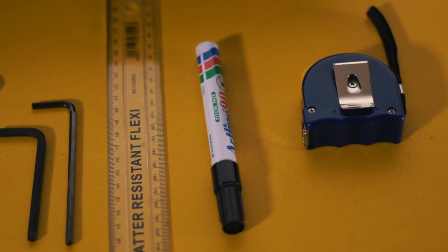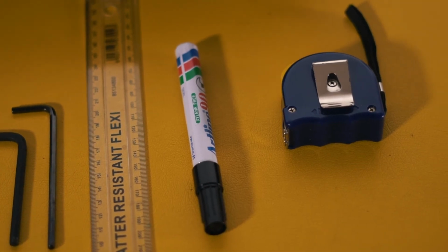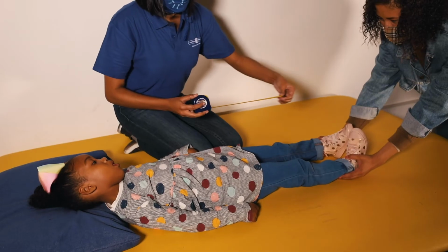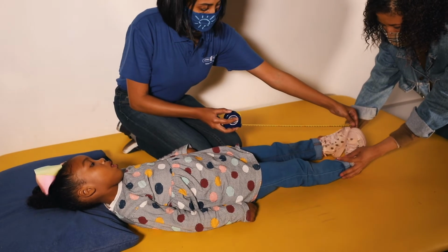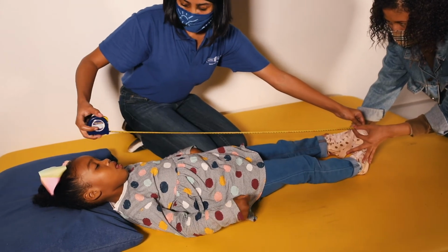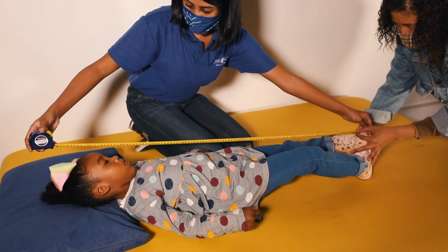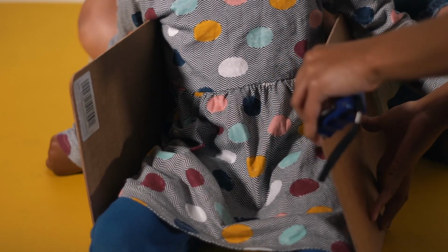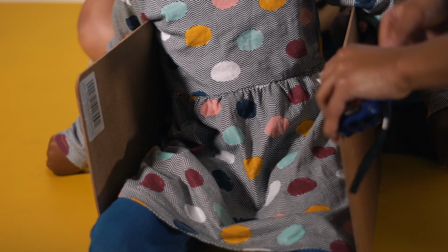When measuring a client for a posture support device, it is important to use a firm industrial measurement tape. The practitioner places the measuring tape in line with the client's feet and aligns it in a straight position from feet to the top of the head. It is important that the measuring tape doesn't bend. The practitioner can ask the carer or parent to support with their hands, or use books or clipboards next to both sides of the widest part of the thighs and hips.